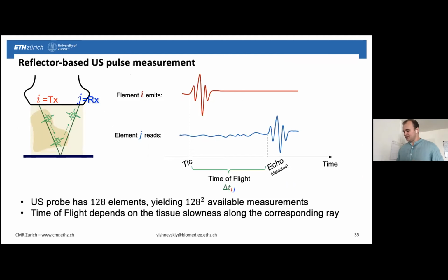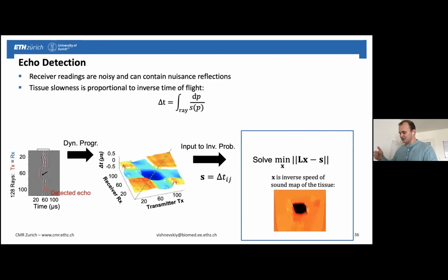So yeah, there is some pre-processing that has to be done to extract those time delays. But what is important is that in the end, we again arrive at a linear system. But the difference here compared to MRI is that in the case of MRI for Cartesian acquisitions, even though we had undersampling, the acquisition matrix was unitary. And gradient descent works quite well for such well-conditioned unitary matrices.